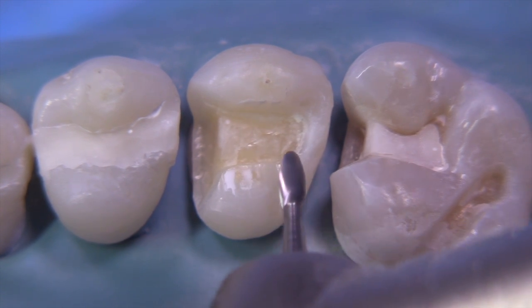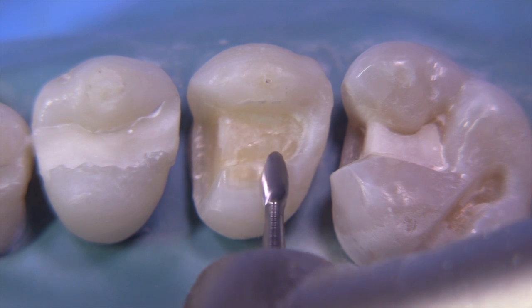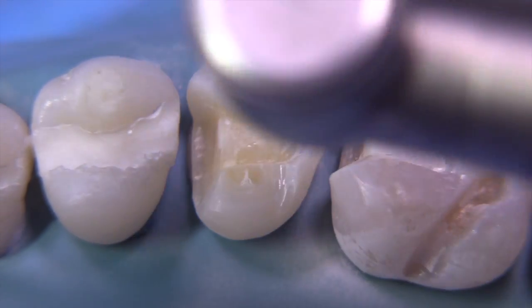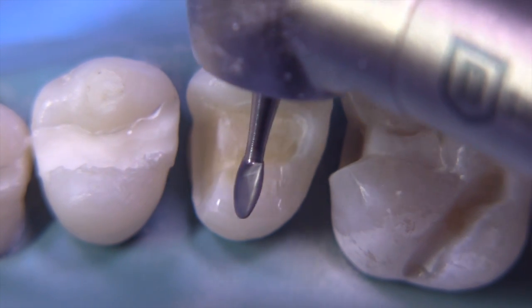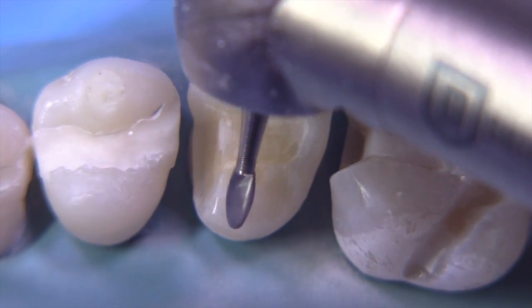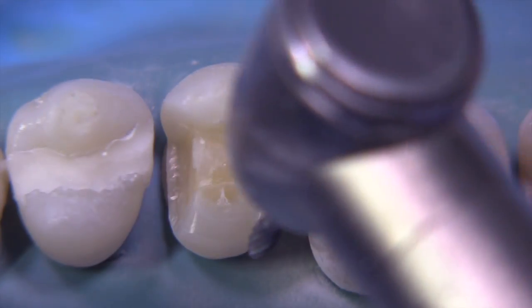You want to keep an idea of how much you are prepping. We'd like to have 1.5 millimeters of gold on top of this. So you have to just either use depth cuts or the thickness of the burr to estimate that. And then, once the rubber dam's off, we can go back and verify the reduction with interocclusal records that we can measure before we're ready to take the impression.